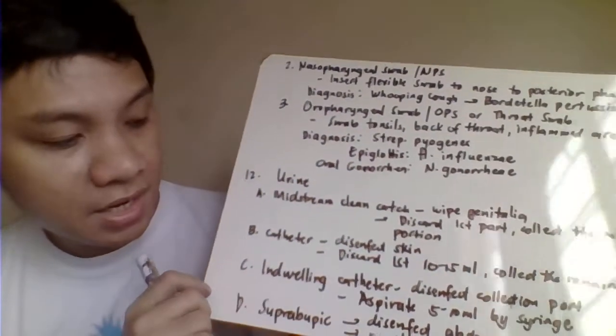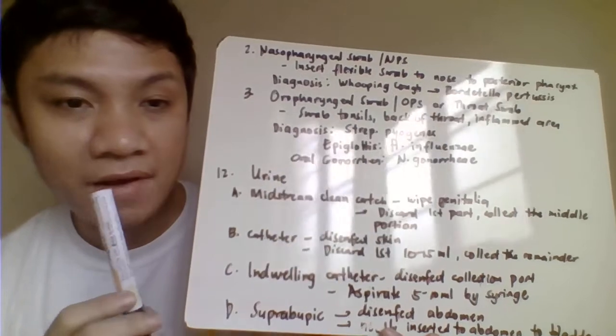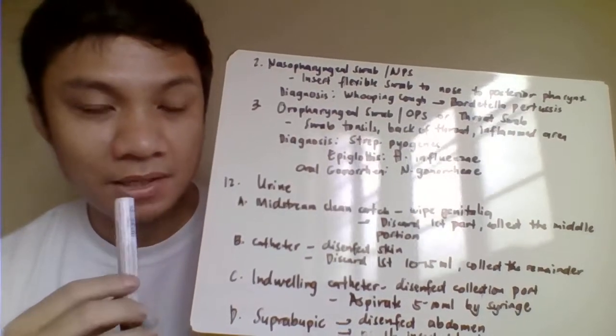Okay, then we have also here your nasopharyngeal swab or you call it your NPS. So you need to use here a flexible NA swab. Insert mo dito tapos papunta doon. Almost one half ng ating swab dapat ay naka-insert.